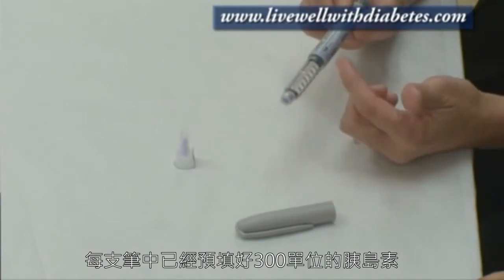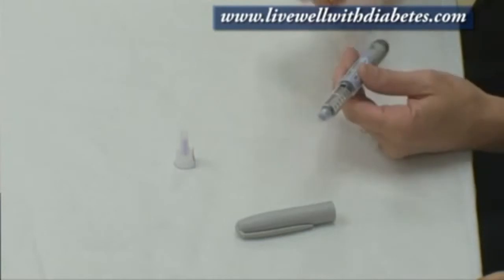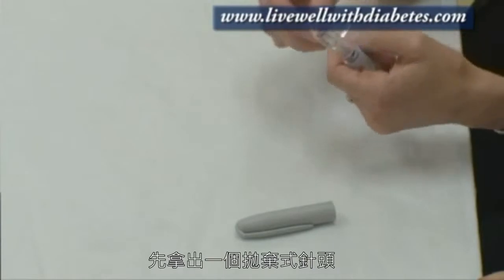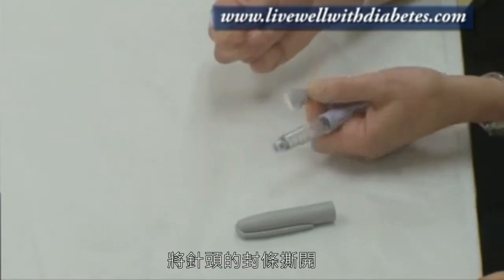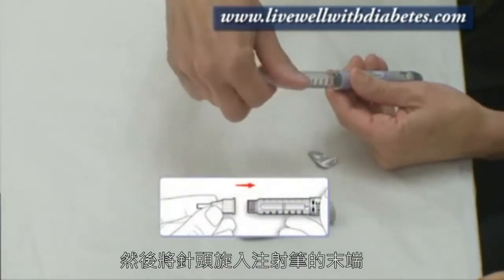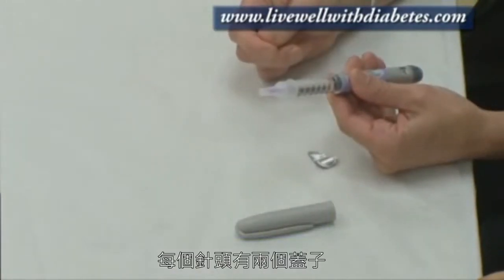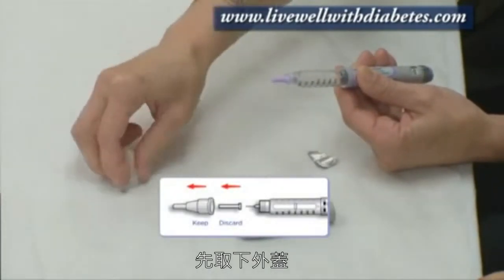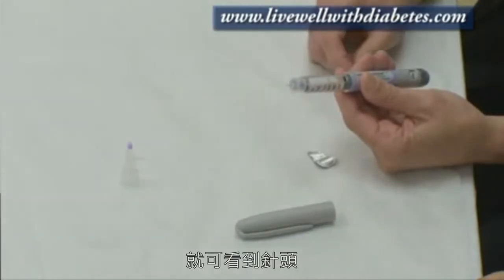Each pen already comes with 300 units of insulin in it. So when you're ready to use a new pen, what you do is take a needle. Each needle comes with a piece of paper on it and you pull the piece of paper off. Then you screw the needle onto the end of the pen. Each pen needle comes with two caps — you pull the outside cap off and then the inside cap off, and there's the needle on that end.